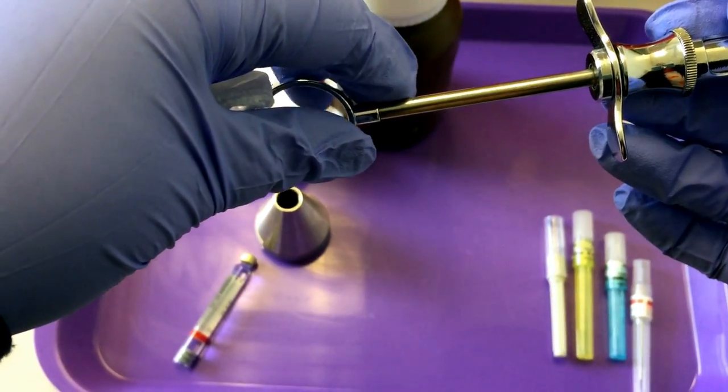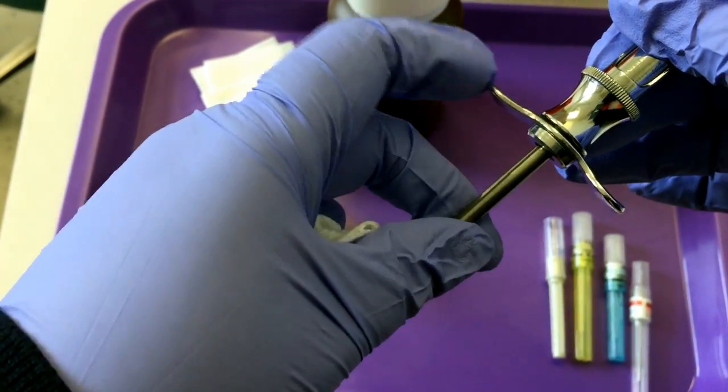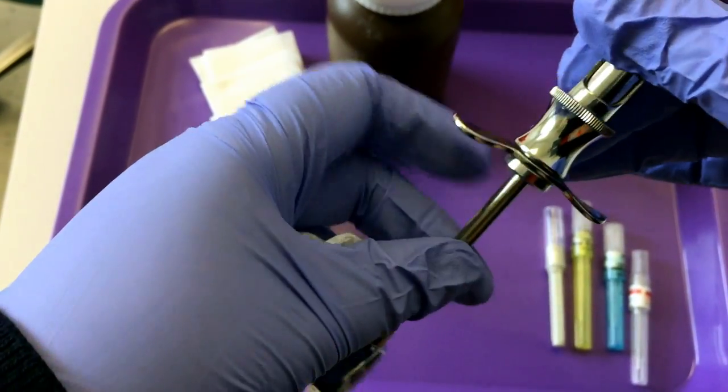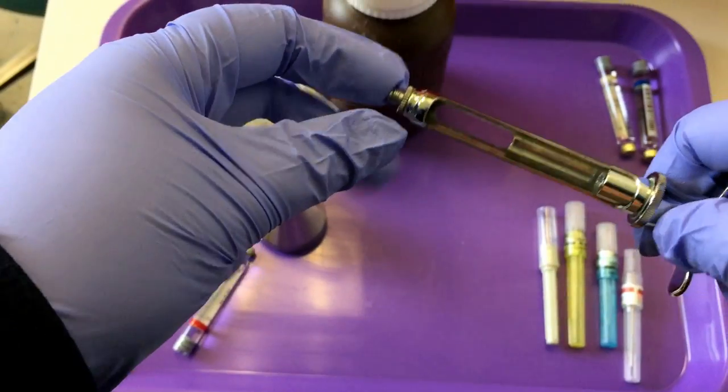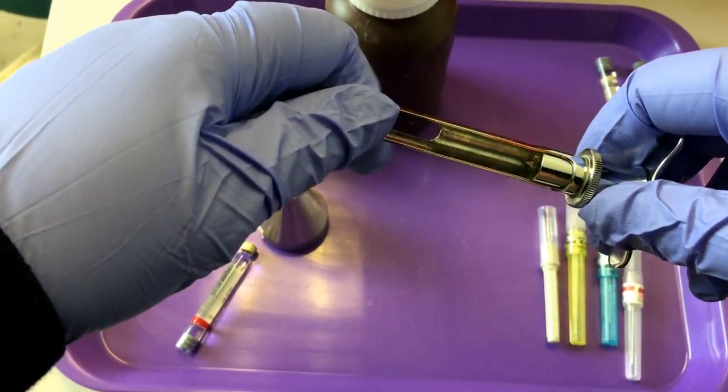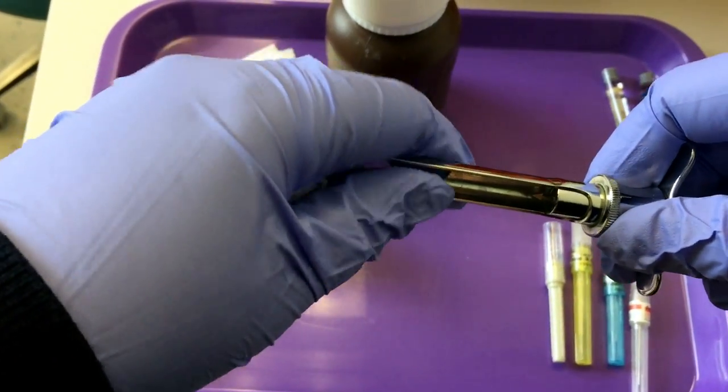You have a piston. You have a finger rest, which is movable. You have your barrel where the carpule goes. Make sure your barrel is tight.